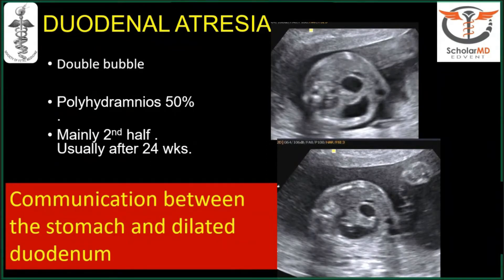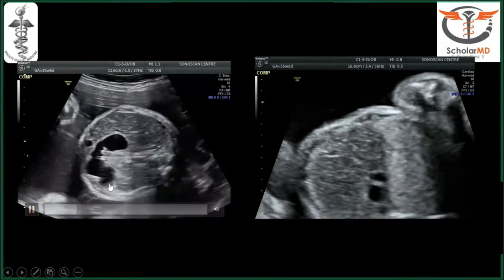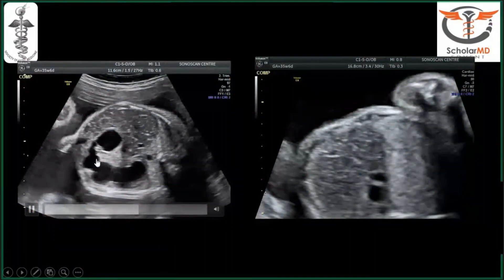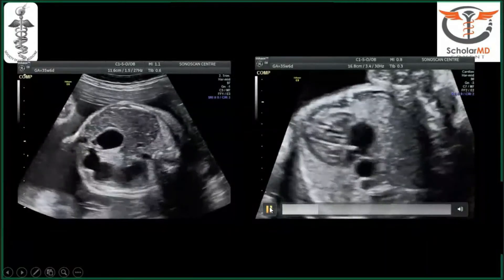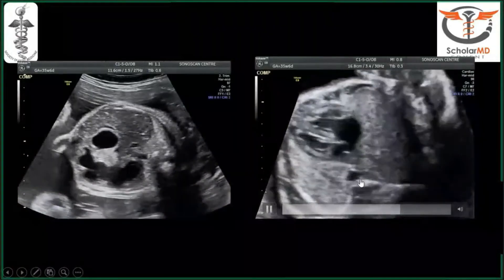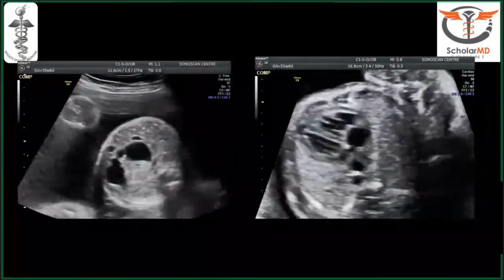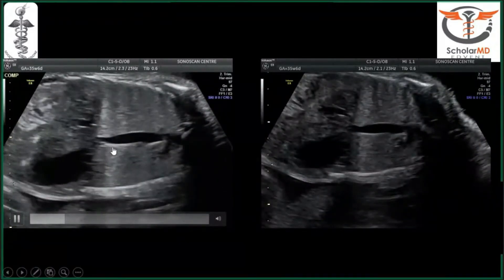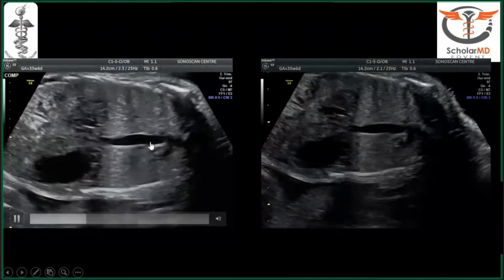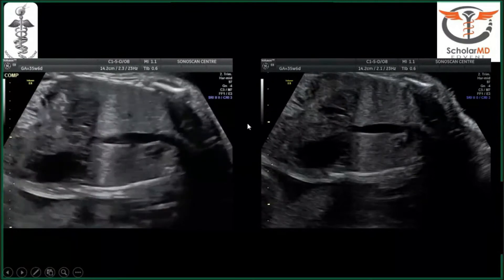You need to demonstrate the communication between stomach and duodenum — two bubbles seen with the communication demonstrated is very important. In one case clip, you can see the stomach and the duodenum with the communication nicely demonstrated. In the same patient, looking at the four-chamber view of the heart, behind the left atrium, you can see a cystic structure which is filling and emptying — that is a dilated esophagus showing retrograde filling, because there is a distal obstruction. This same finding can be seen in pyloric stenosis.